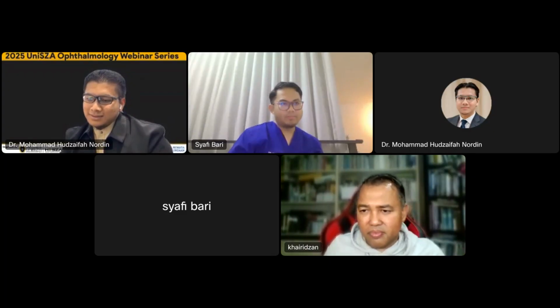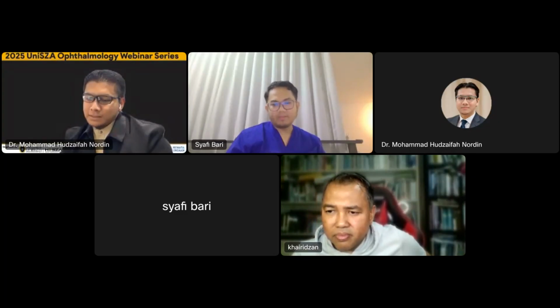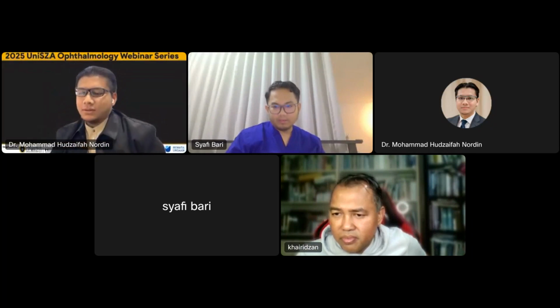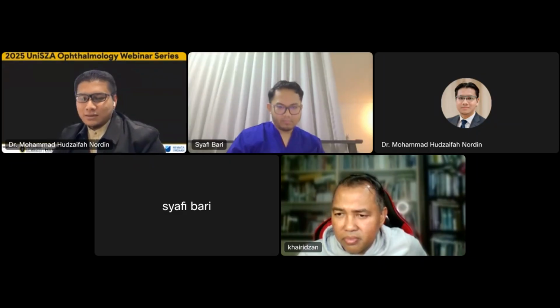Another question is from Dr. Kamal. Salam, Dr. Hu. What is your practice preference for aiming in myopic patients? If we look at the defocus curve, we should aim towards emmetropia. So, yes, I carry the same sentiment as Dato with this one. For all patients, I always aim at emmetropia. We have the perception that for those who are myopic, we always aim a bit minus, claiming that the myopic patient likes minus.